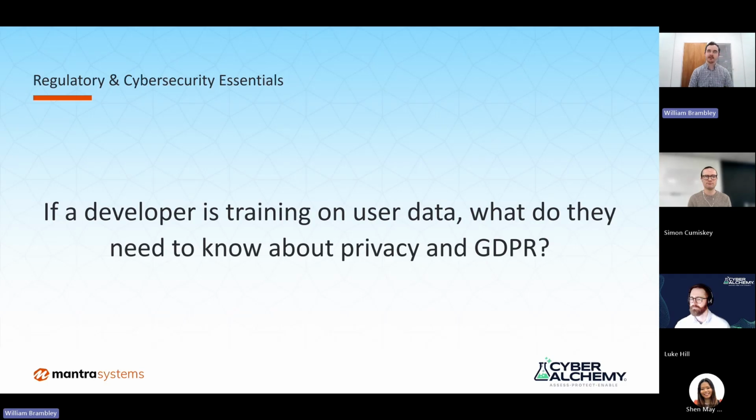Yeah, that's very important. I think back in the 60s, there was a pain questionnaire developed in Leeds in the UK, and it was groundbreaking in the sense that, although obviously not an AI device, it was an early attempt to train a questionnaire to be specific for abdominal pain, I believe. Then they took that model over to Norway, and it performed really poorly, purely because of the difference in how Norwegian people describe their pain compared to the Northerners, and it made a big difference.